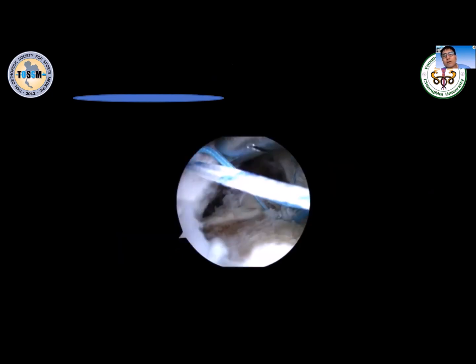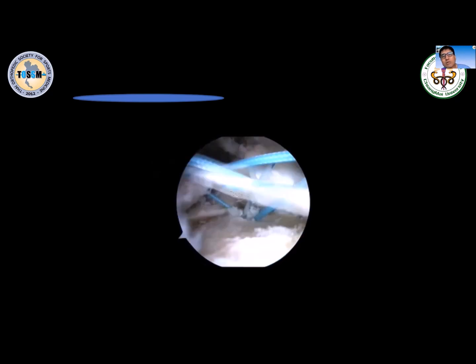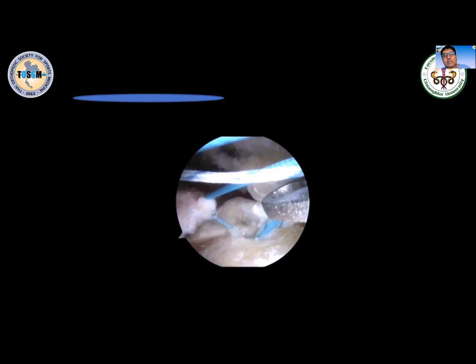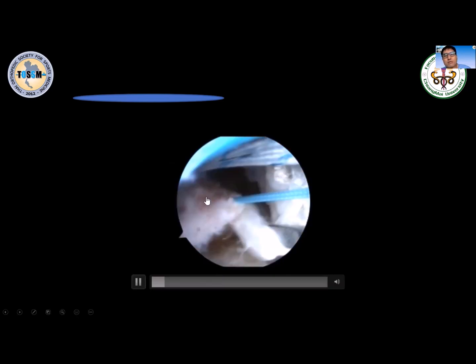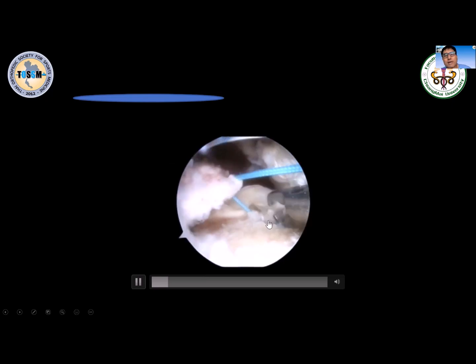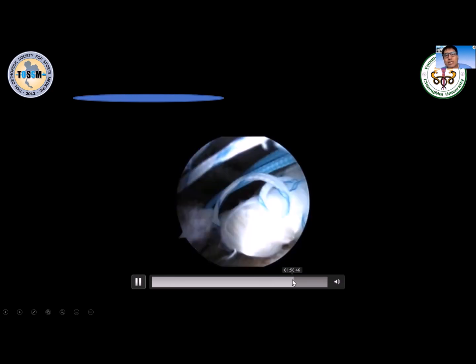So this video is about how we stitch the infraspinatus back to the hole like that. It's almost like a simple cuff repair, but you put the infraspinatus back down here and put the bicep back down here. So again, like that. And then you start to tie.